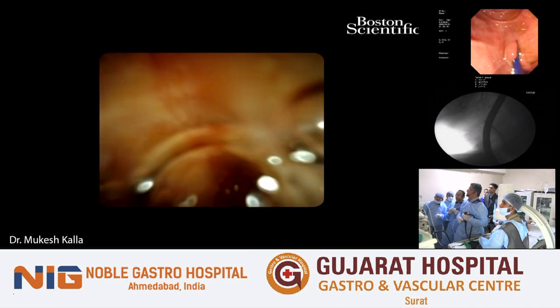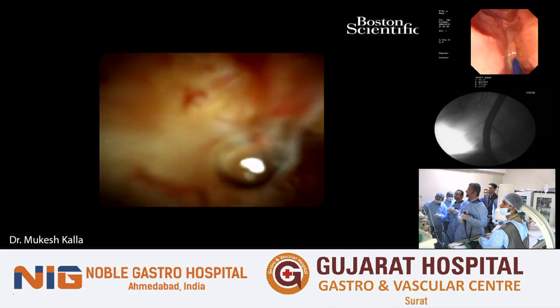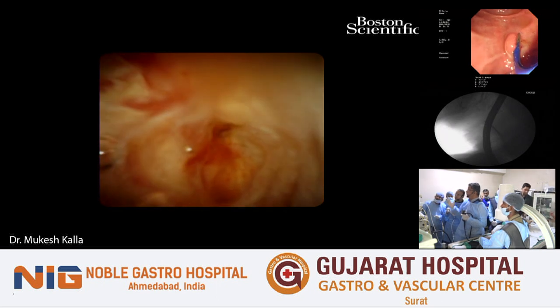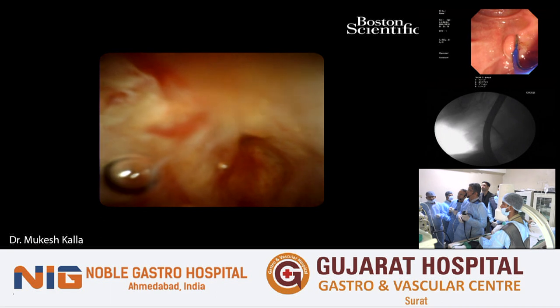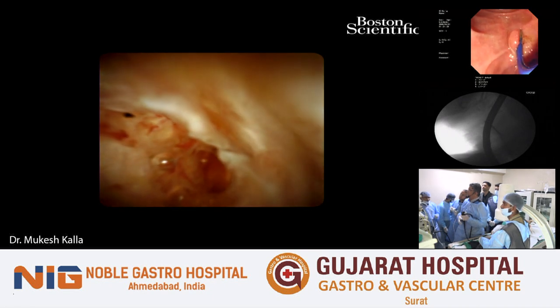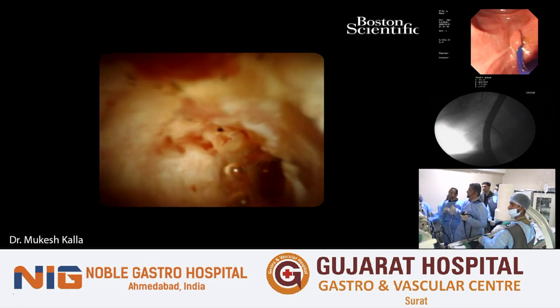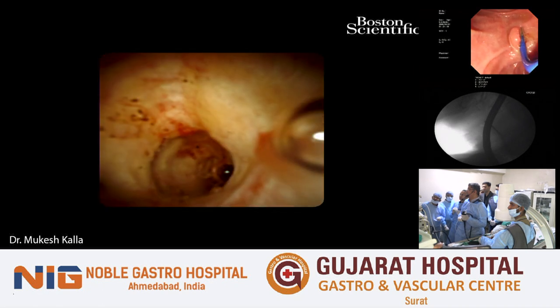Wonderful. So this workshop today is about cholangioscopy. The nearest competitor for cholangioscopy is laparoscopic CBD exploration. When you review the data, lap CBD exploration scores over cholangioscopy, because it manages both things in one go: the gallbladder is removed and the CBD exploration is done as well. But unfortunately, lap CBD exploration has a steep learning curve. The expertise required is more and the time consumed is more. If you have a laparoscopic surgeon, then it is an institutional choice which methodology you want to use. But for an impacted stone, which is an ERCP failure, cholangioscopy is an easy procedure to do, which would probably take 35 to 45 minutes to get the stone out.